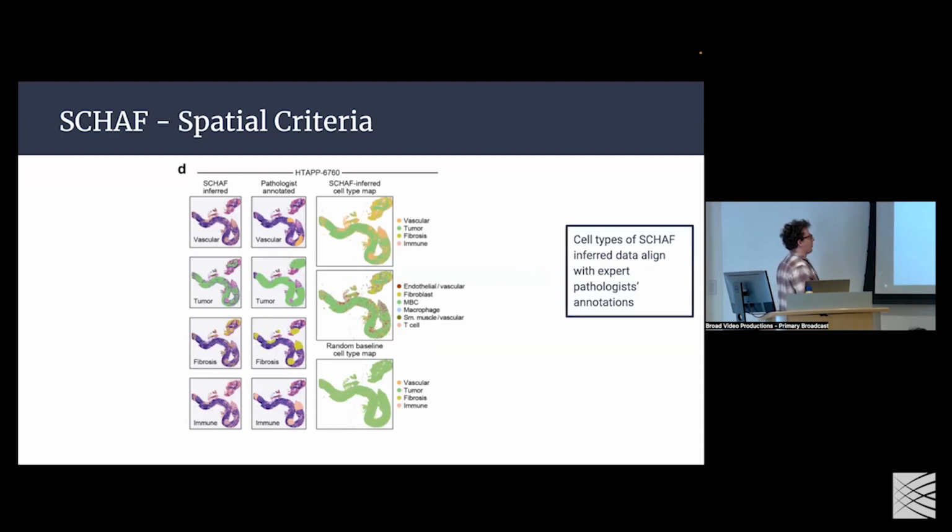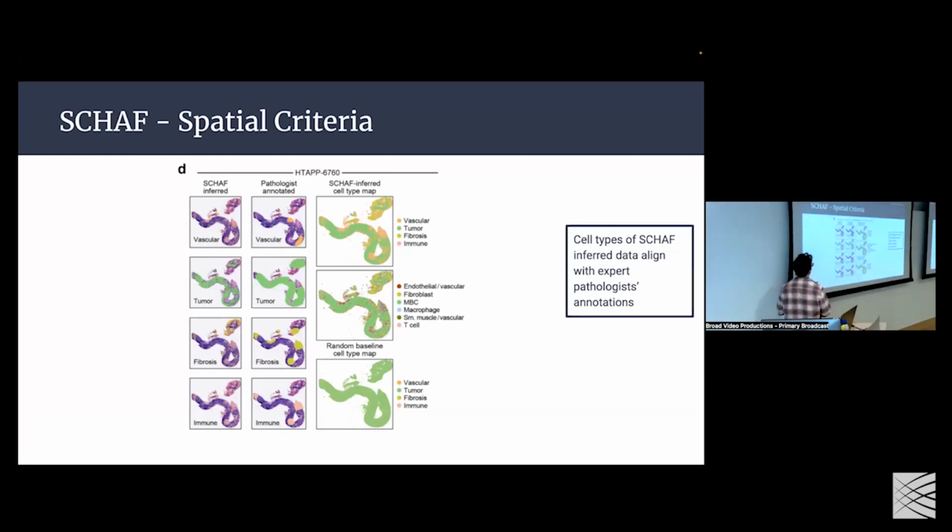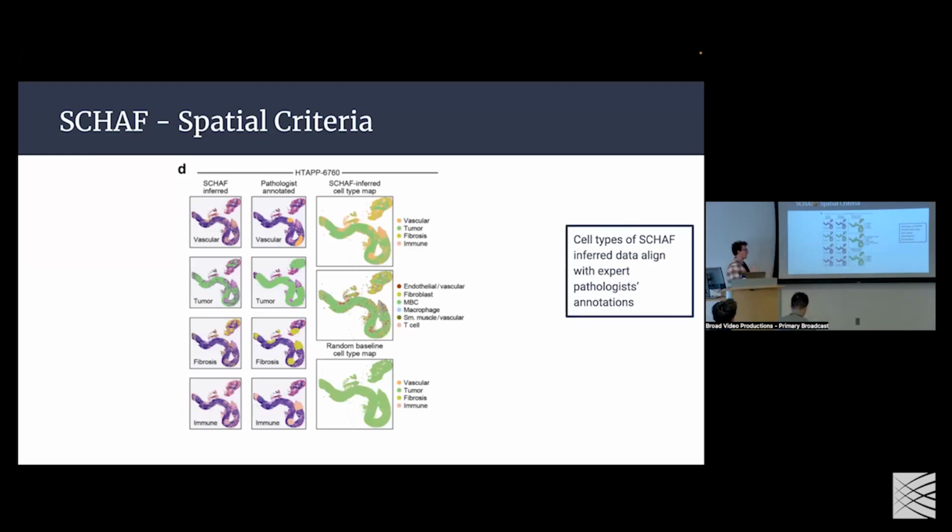And then what is, to me, the most aesthetically pleasing, but also probably the most encouraging result, is that we can look at a visualization of cell types. I think this is a very nice summary panel. Say we have a histology stain, seen in the top left, and we put it through our model and get the spatially resolved transcriptomic data. Then we can do cell type labeling. I'm not going to go into the specifics, but there's very basic automated cell type labeling that we can do. Once we have that, you have what we have in the far right column: our tissue, color coded according to cell type.